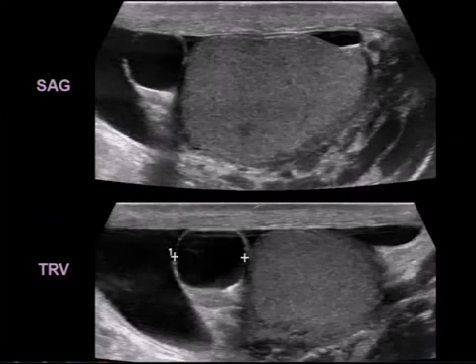So this patient has an epididymal head cyst. Here you can see the testicle is normal, but above it we see a well-defined cyst here and here located in the epididymal head. And as I said, they're typically anechoic with thin, smooth walls.